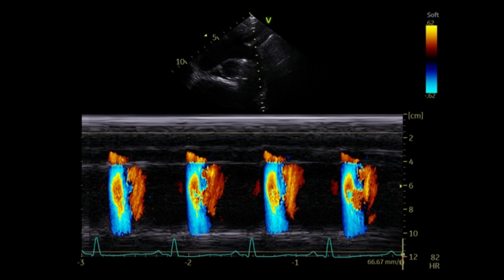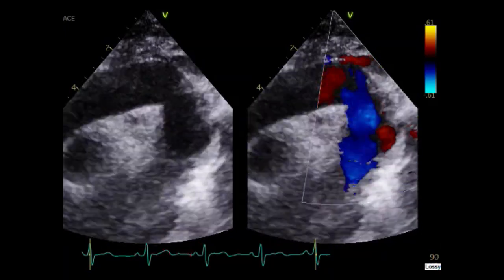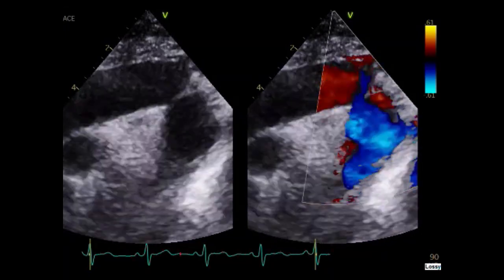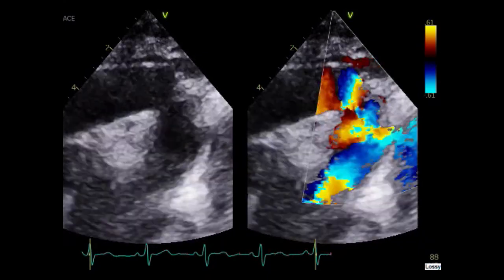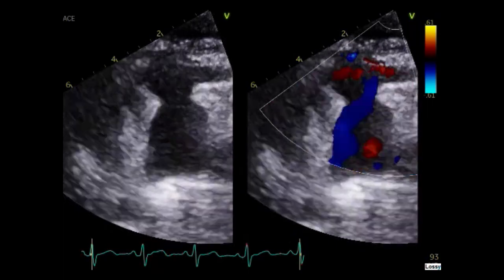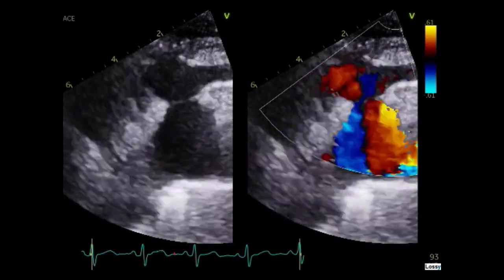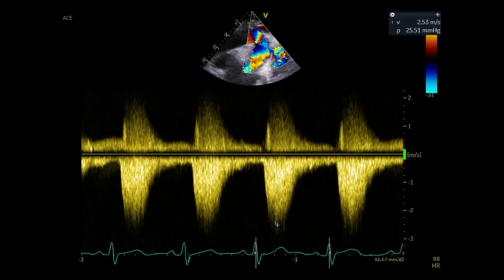Now let's watch some examples of aortic abnormalities. This is an example of an aortic coarctation — here you can see a narrowing and also turbulent flow in the aorta. When you modify the angle, the aortic coarctation becomes more evident. Place the cursor on the descending aorta and use continuous wave Doppler to measure the peak velocity of the aortic coarctation.